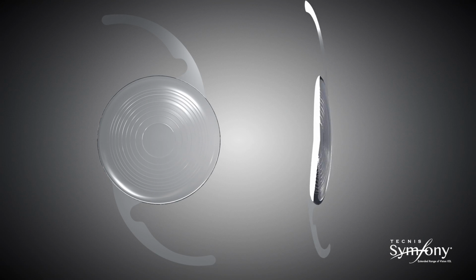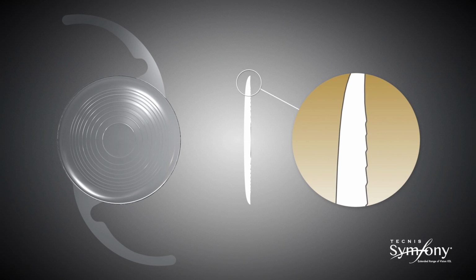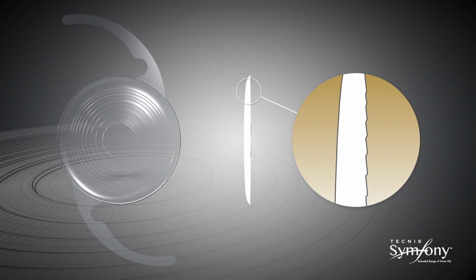As a matter of fact, light can be distributed in almost any desired way by modifying the echelette design of the diffractive lens. The echelette is the relief or profile of the lens, meaning its height and shape within each ring. The design of the echelette determines how the light is transmitted through the lens.